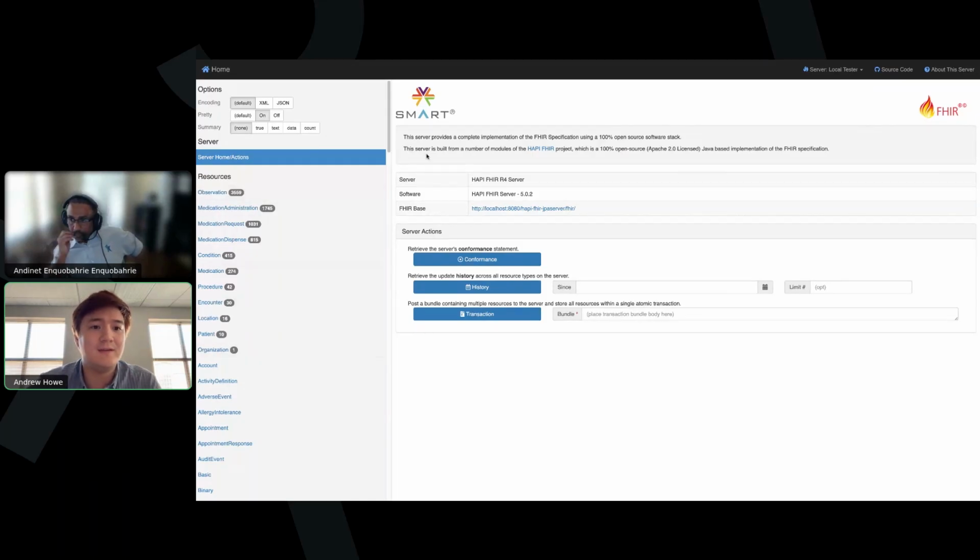So you can think of this interface here as an interface to an EHR system. So Epic or Cerner would be exposing the data in the EHR through these FHIR resources. And the reason I'm using FHIR here is because, again, it's very developer friendly. It's easy to iterate on. If you are a research group trying to test a clinical deployment with fast iteration, you might want to use something like FHIR. But if you're in a clinical context connecting with a real live EHR, such as Epic or Cerner, you would then be connecting to those, but still communicating via the same underlying resources.